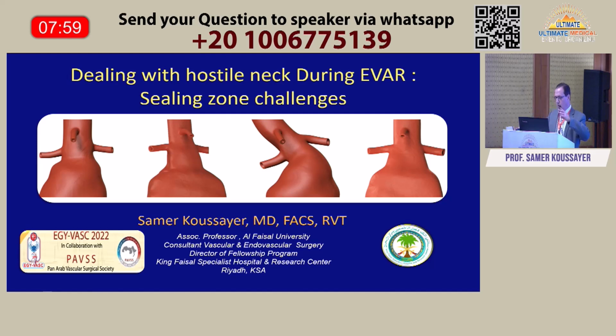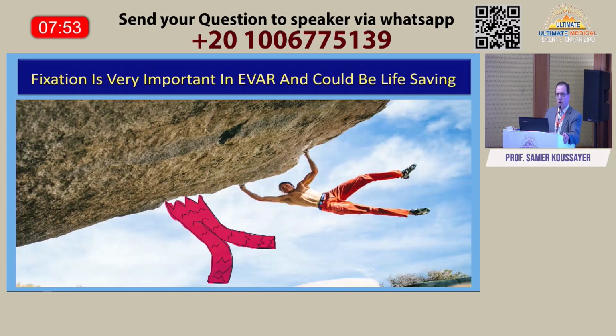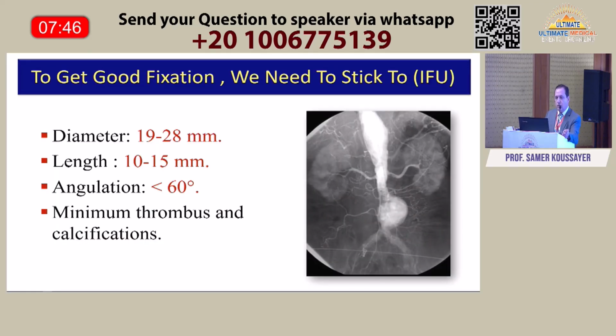Good morning, everyone. I'm going to speak about sealing zone challenges during EVAR. We know that fixation is very important in EVAR and could be life-saving. To get a good fixation, we need to stick to the IFU. So we need to have a length of at least 10 to 15 millimeters, and angulation should be less than 60 degrees.